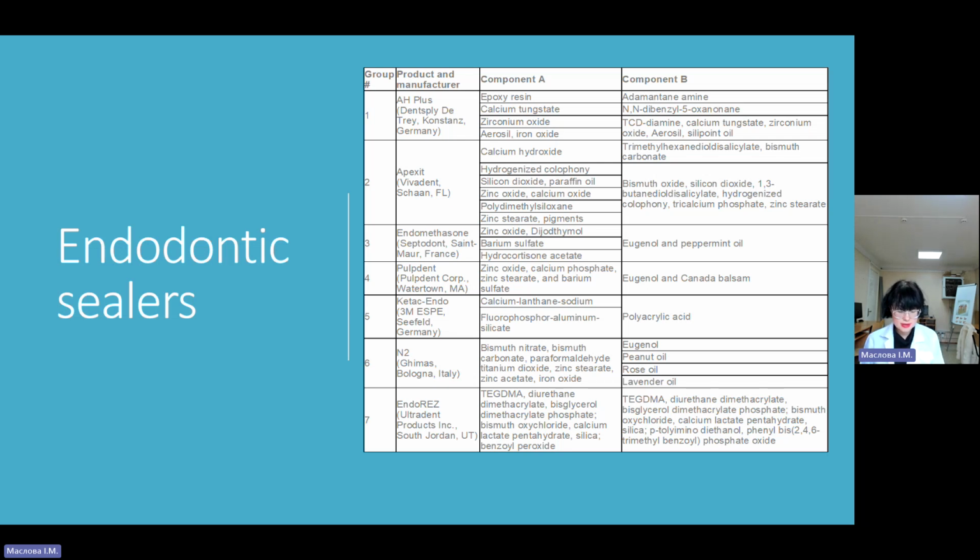Calcium hydroxide sealers have been reported to be both soluble and cytotoxic. The seal achieved is similar to that produced by zinc oxide eugenol sealers. For example, Sealapex is a calcium hydroxide sealer with iodoform, which gained U.S. Food and Drug Administration approval. This material exhibits excellent radiopacity, but must be avoided in patients with an allergy to iodine.